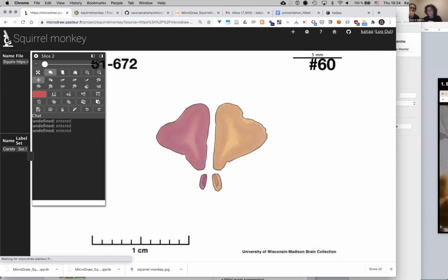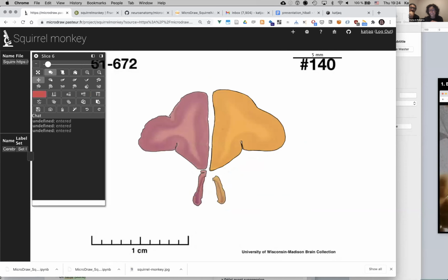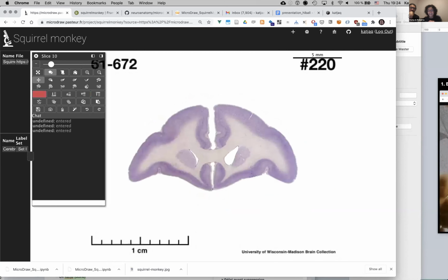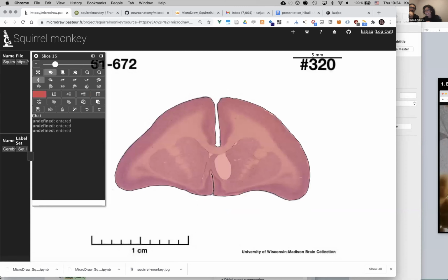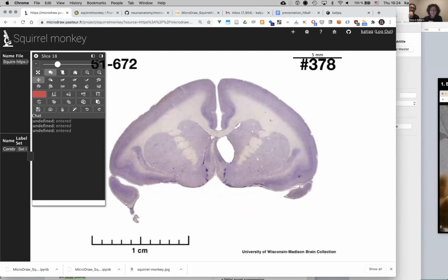Sometimes I'm invited to give a presentation, and the night before, when I just have a look at the tool that everything works, it's in one state. And the next day I give the presentation, it's already almost done, the data set. It's wonderful.